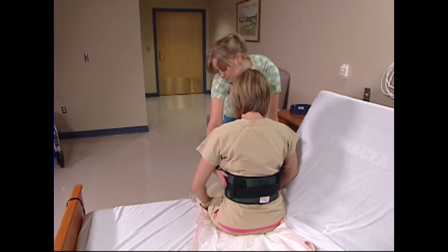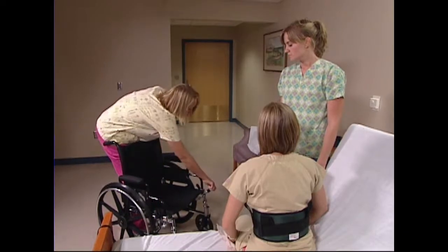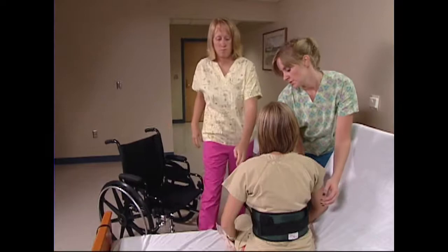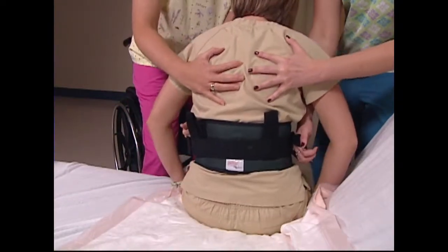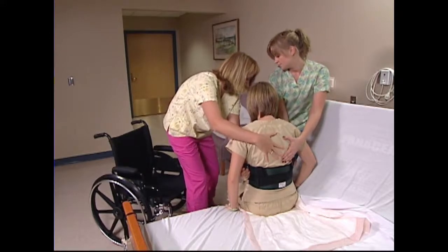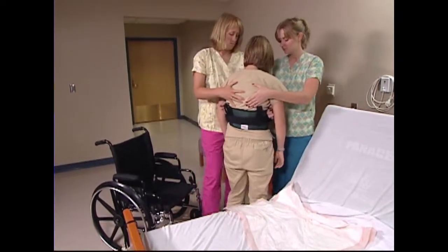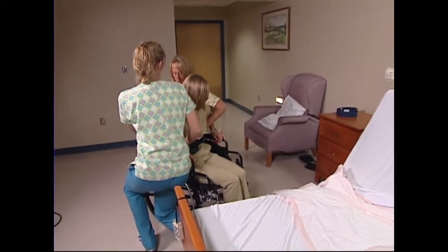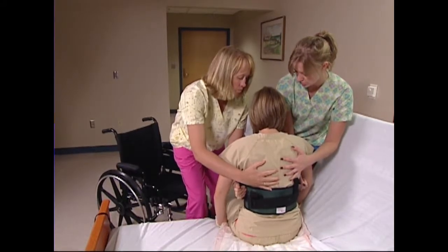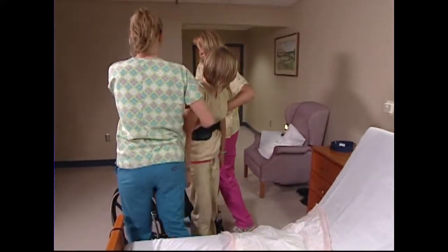Position and lock the wheelchair in place at approximately a 45-degree angle, about a foot away from the bed. If the resident is compromised and has a weaker side, always place the wheelchair to the resident's stronger side. Move the resident to the edge of the bed. Using the gate transfer belt, ask the resident to tuck their feet under their knees and lean forward to assist with standing up. Always allow for a count of one, two, and three before transferring. Counting provides a smooth, safe start for the caregivers and a prompt for the resident. On the count of three, stand, then pivot towards the wheelchair, bend your knees, and lower the resident into the chair.